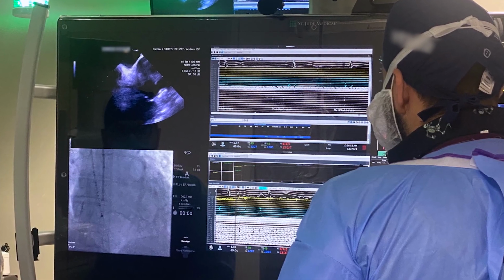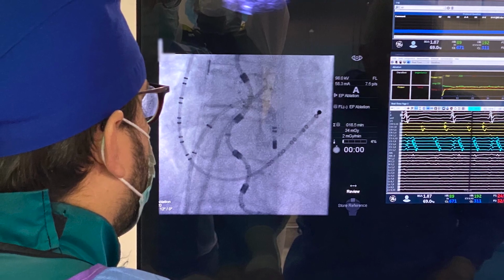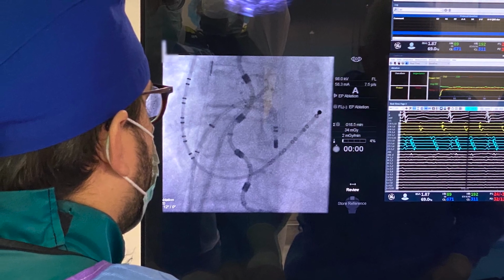And so I started on this journey thinking, okay, do I really need to do this? And so for me, and I guess I'm a slow learner, it took me about 5 years to teach myself how to put aside the X-ray. And so I've been fluoroless for all ablation procedures since 2013. And I'm an advocate for it, but I'm not a zealot.